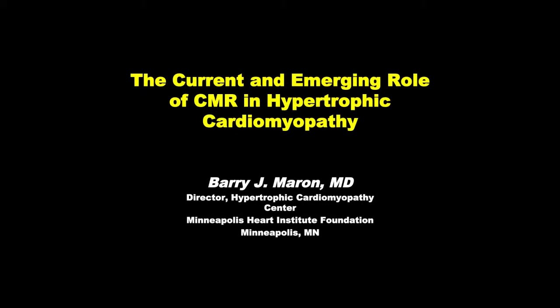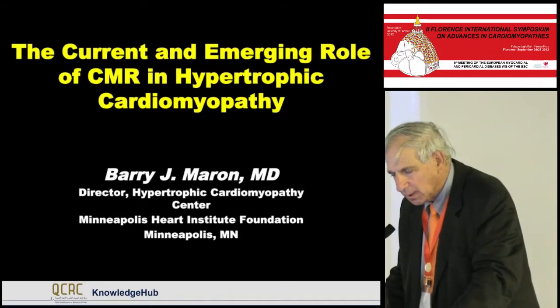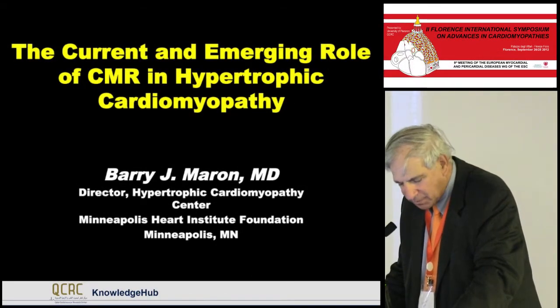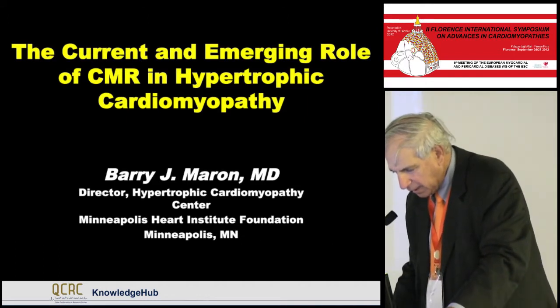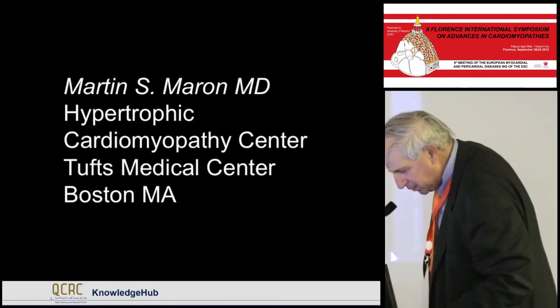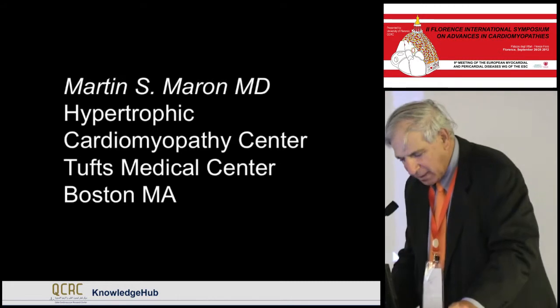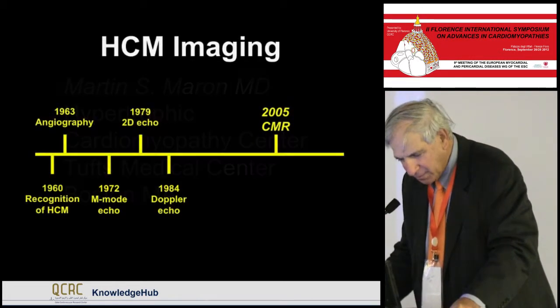Good afternoon. I am going to try to take you through some of the clinically applicable observations on MRI. I need to tell you that I'm here replacing my son, who is the actual investigator responsible for most of these data. Couldn't be here, although he wanted to be.